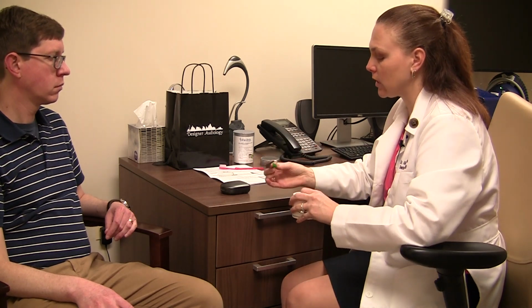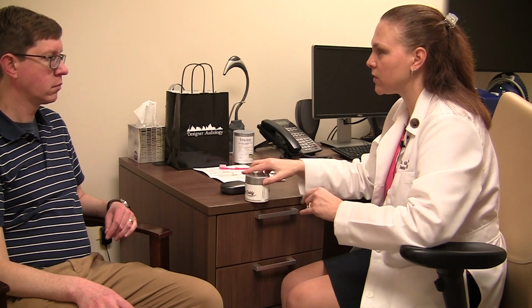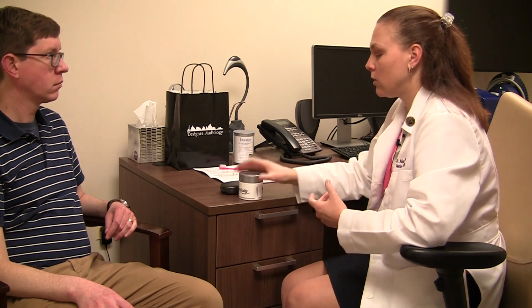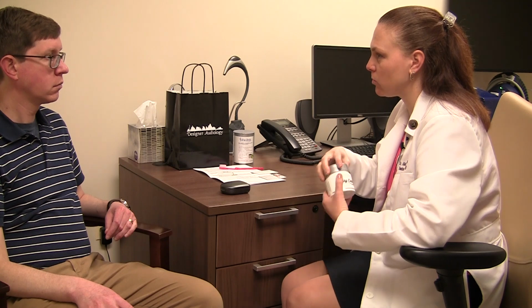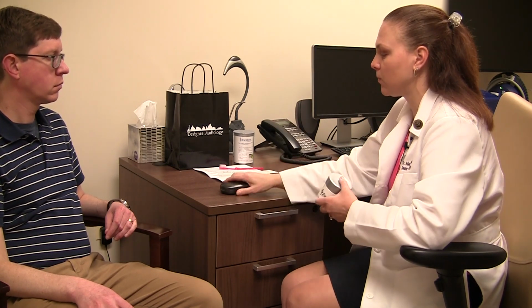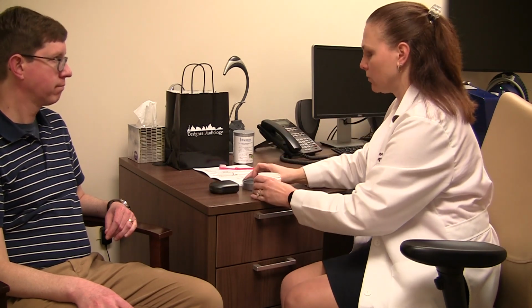We're going to turn the hearing aids off, put both of them in, and put the lid on top. And that's going to dry out those hearing aids overnight while you're sleeping. You can put both of them in here, no problem. Again, just make sure you put the lid on to help it dry out. And so we're going to use this at night and this during the day if you need it. Good so far?